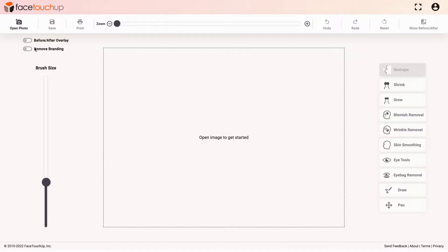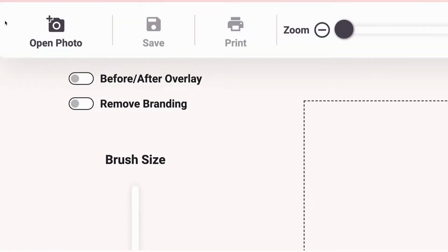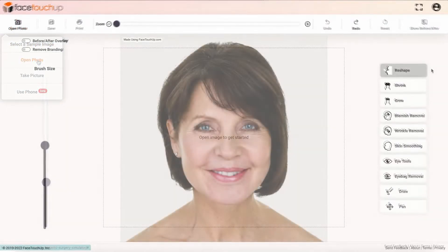To simulate a facelift on the simulator, you will need a front view of the face. Add an image by clicking the Open Photo button. After you have selected an image, move on to the tools.